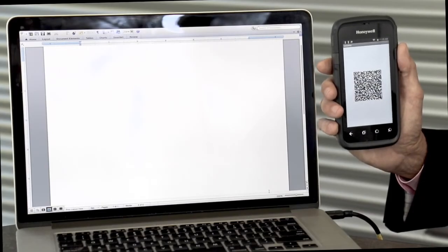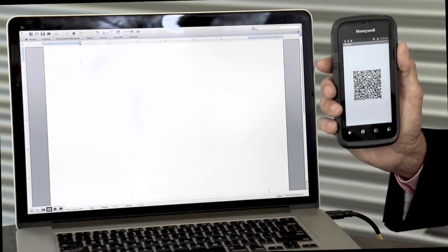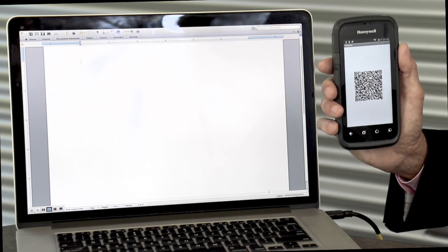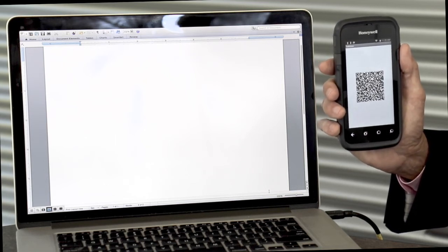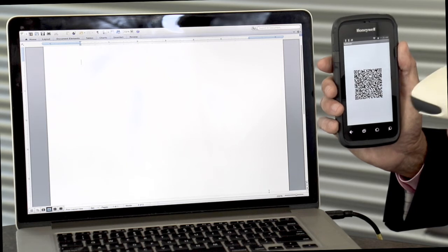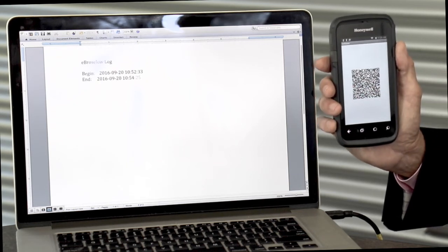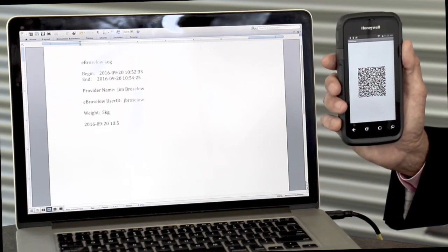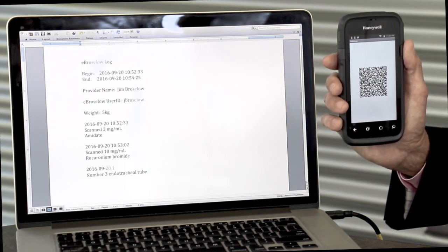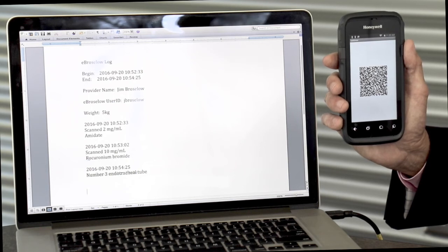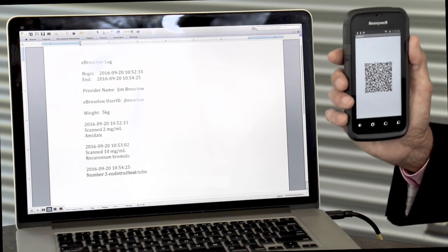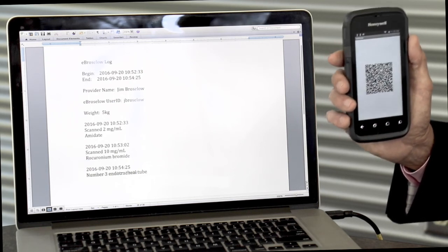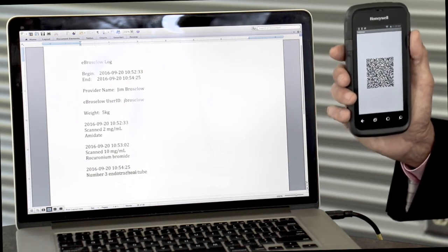I will use a tethered scanner like the type that is in most hospitals in the US. I will scan into a text box the barcode, and as you can see, it duplicates the entire log that was made offline and does this into an online system.